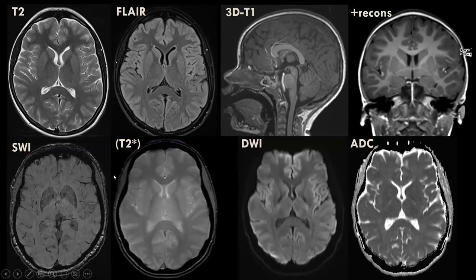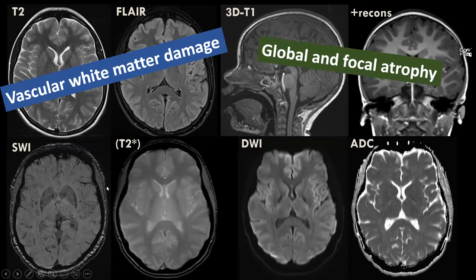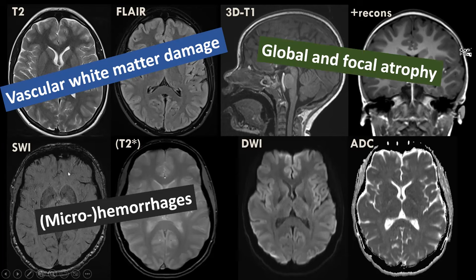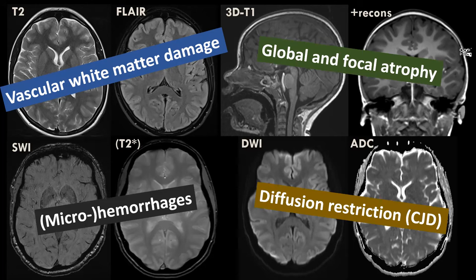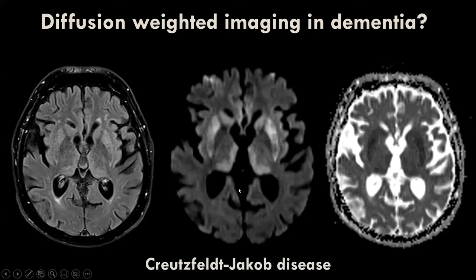T2 and FLAIR are mainly used to evaluate vascular white matter damage. 3D T1-weighted images assess global and focal atrophy. Susceptibility-weighted or T2-star images detect microbleeds. Diffusion-weighted images detect areas of diffusion restriction — especially important in patients suspected of having Creutzfeldt-Jakob disease. This patient with CJD shows subtle signal increase in the basal ganglia and thalamus on FLAIR, with corresponding diffusion restriction on DWI and low signal on ADC map. Another CJD patient shows mainly cortical involvement.